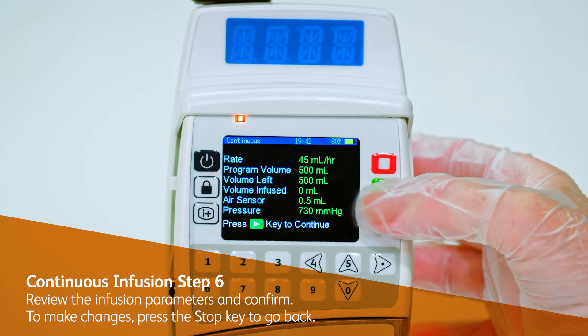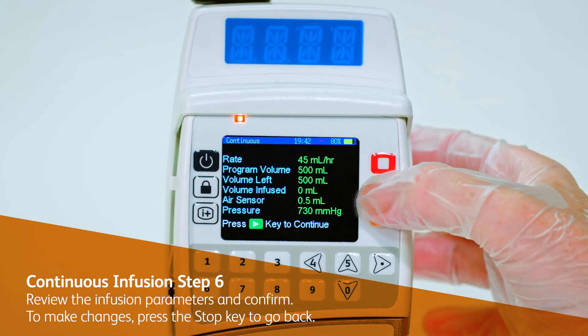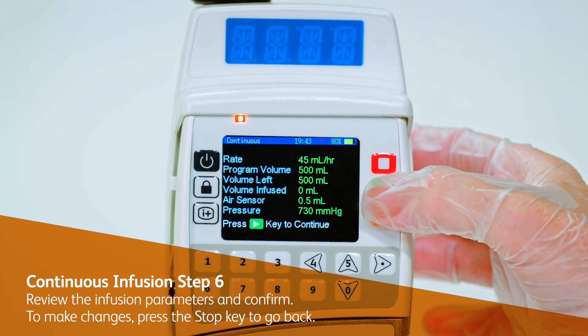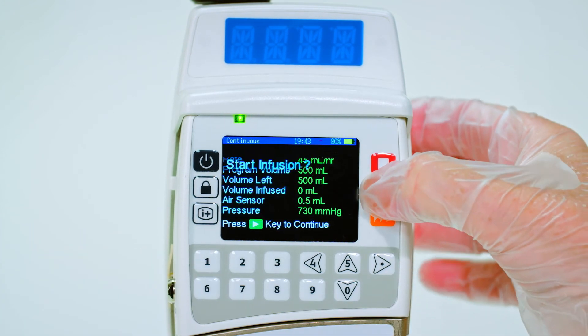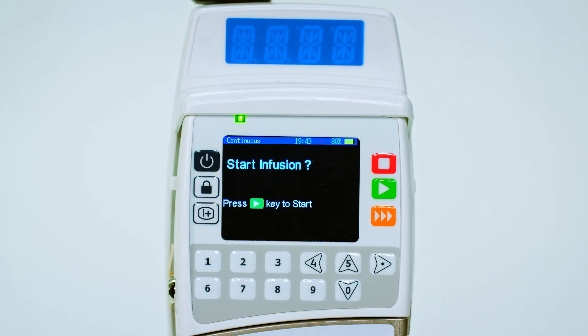Review the infusion parameters and confirm. To make changes, press the stop key to go back. Once you've reviewed the infusion parameters, you will be asked to start the infusion via the on-screen display.